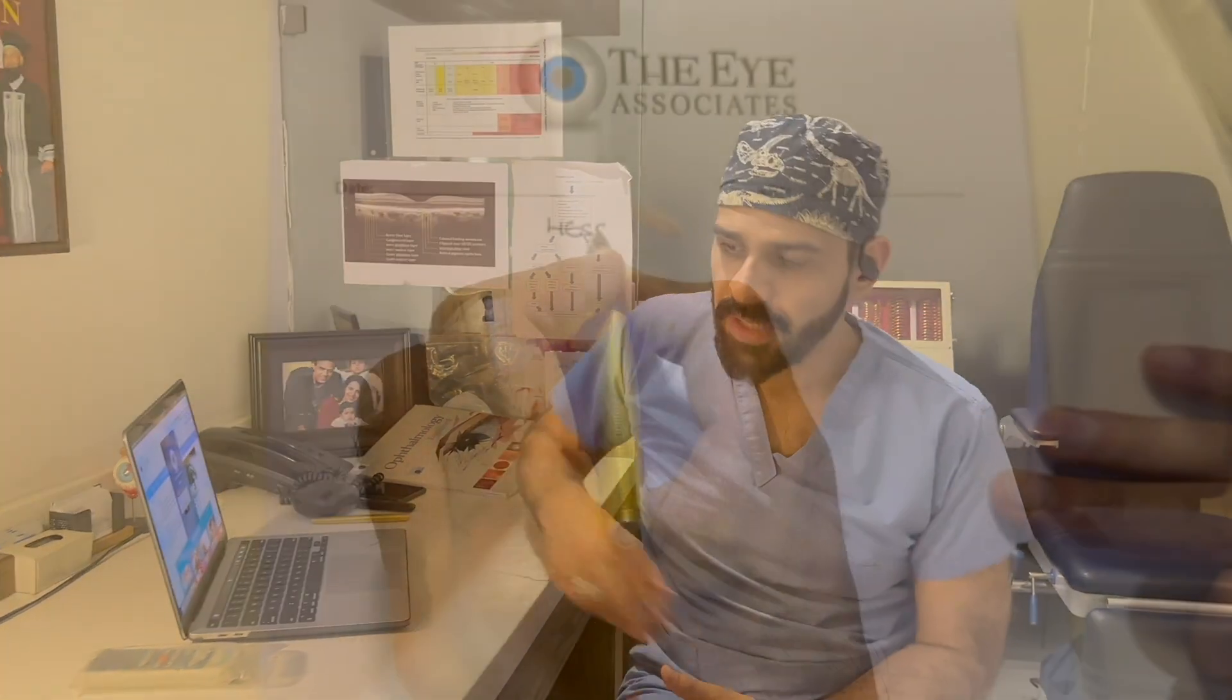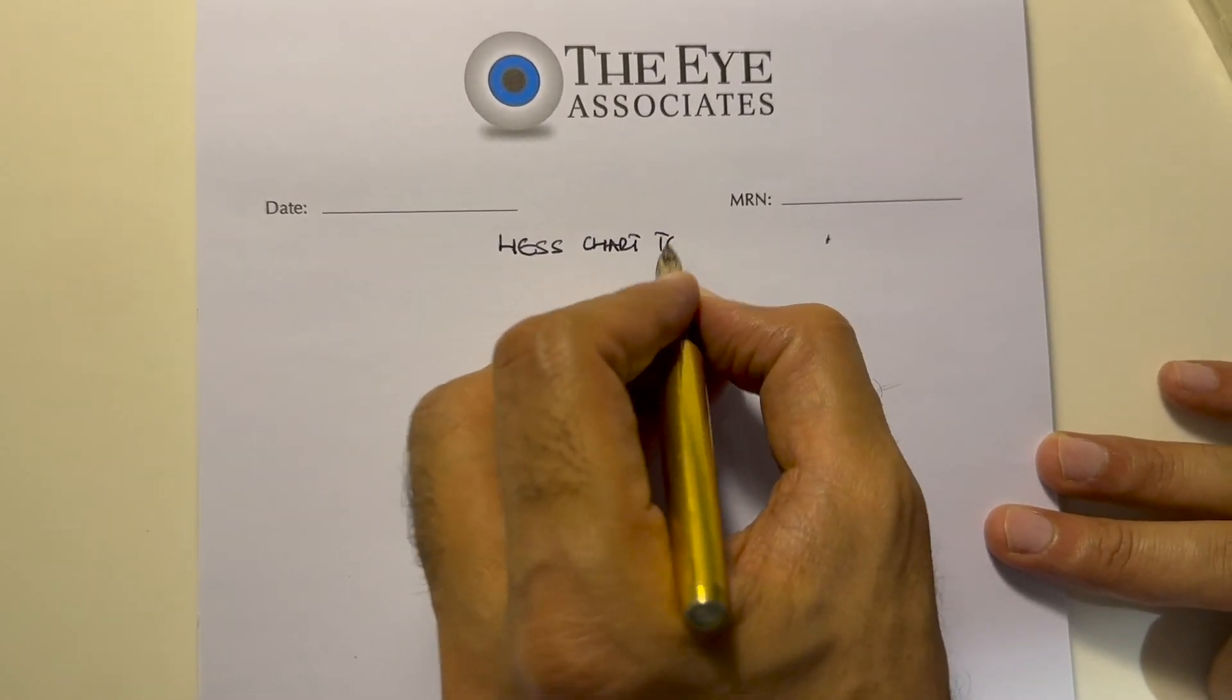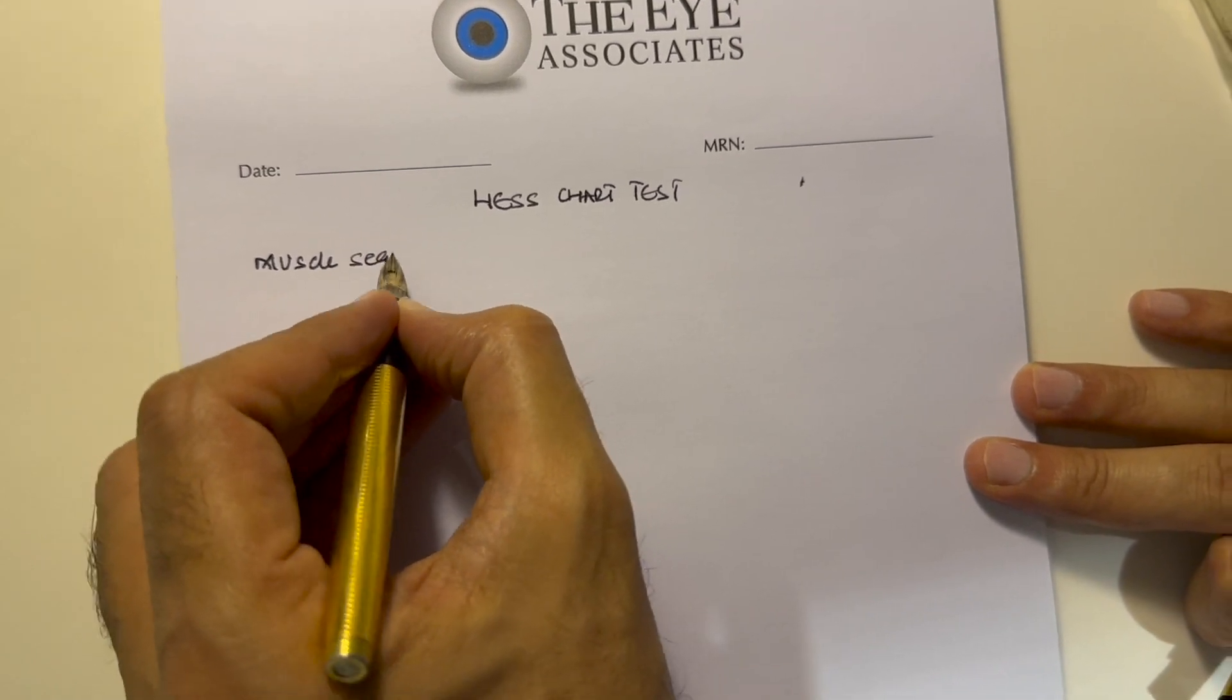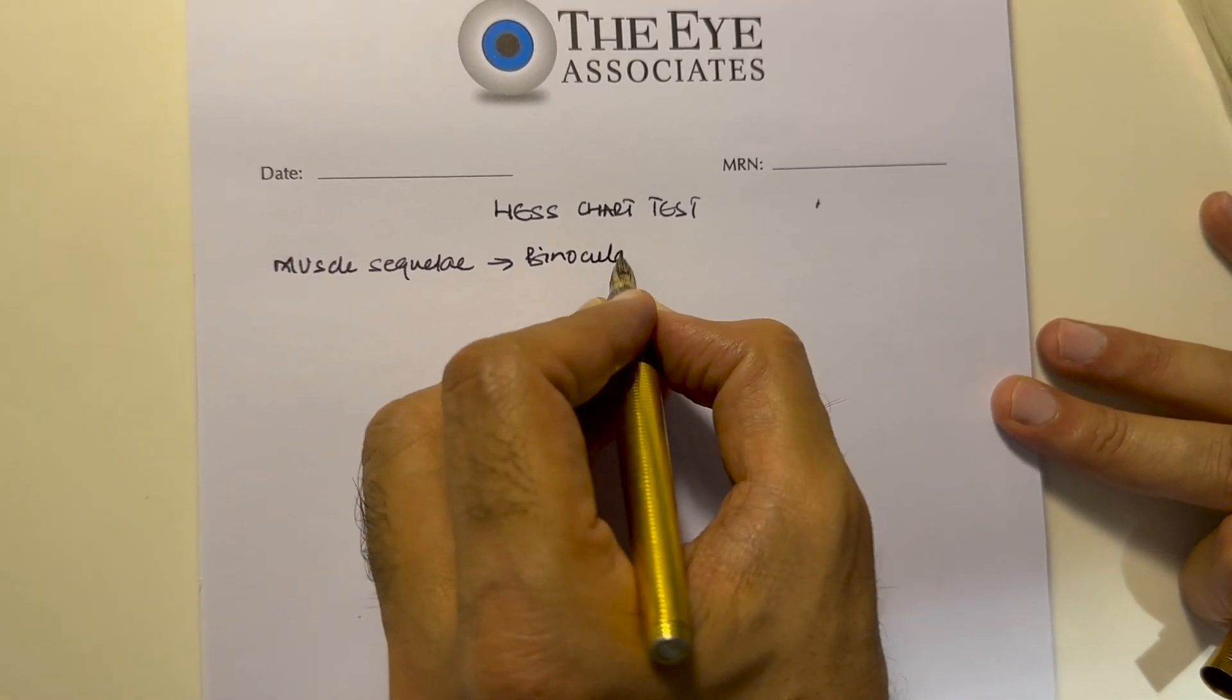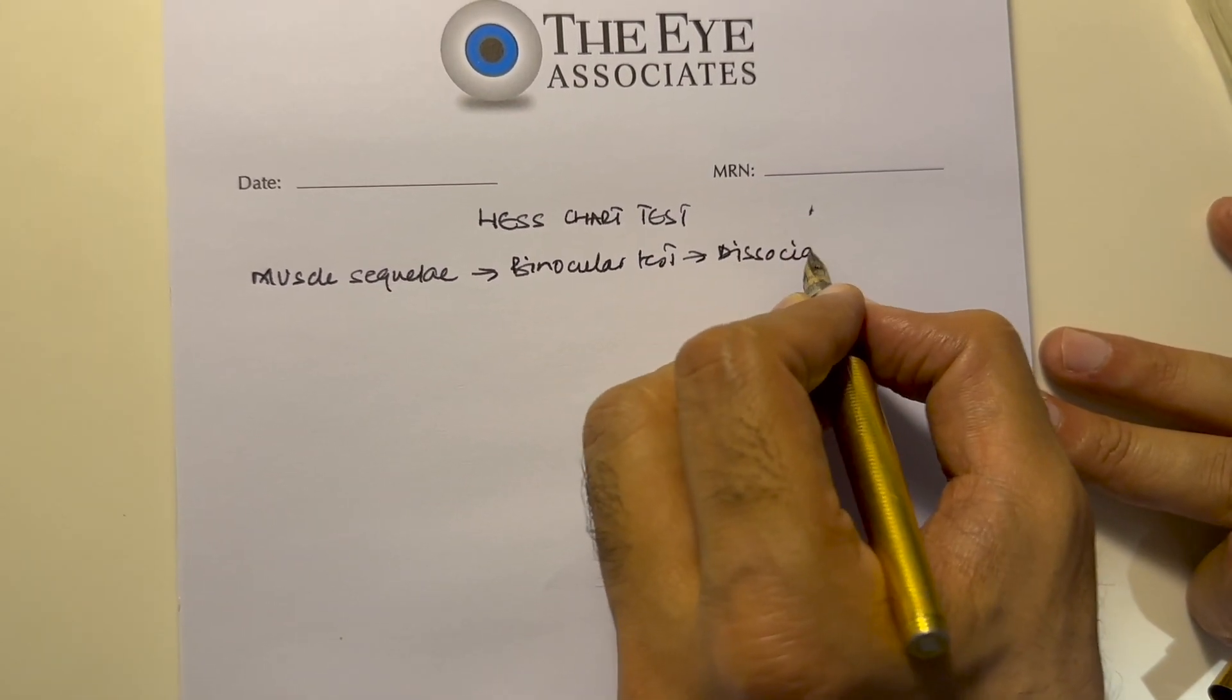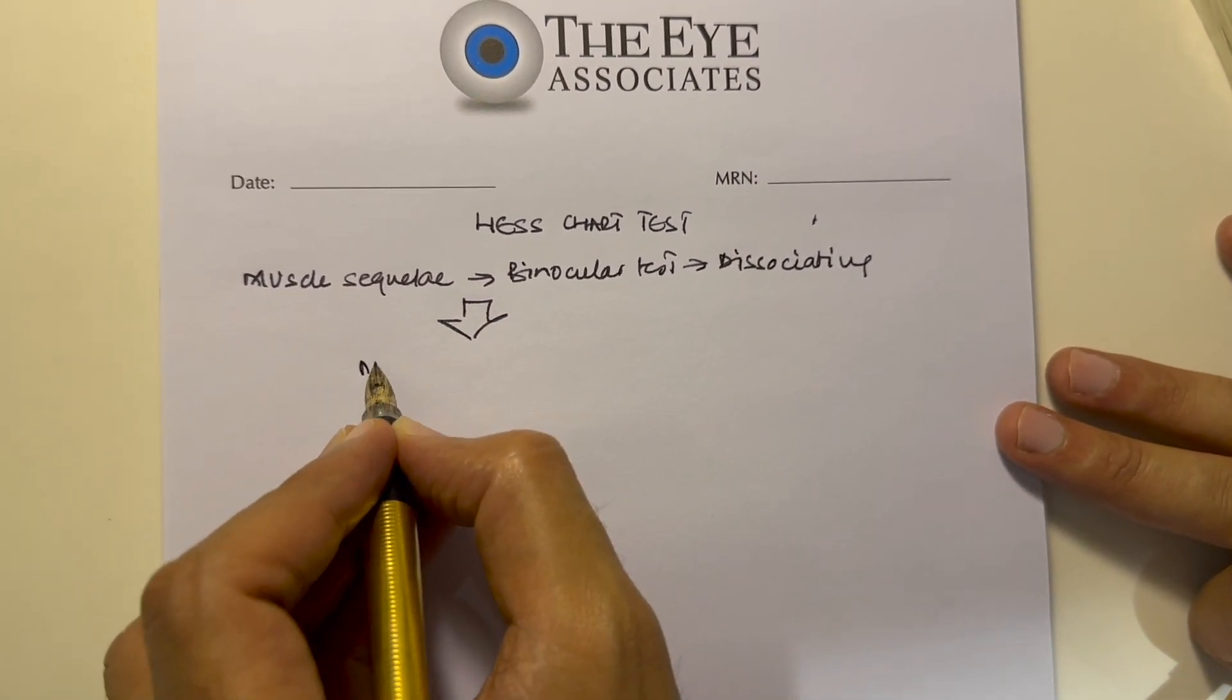This is Aliyaz and we are going to study the interpretation of a Hess chart. A Hess chart is basically used for testing of muscle sequelae. It's a binocular test where we are dissociating the two eyes and then plotting a chart showing extraocular muscle movements.